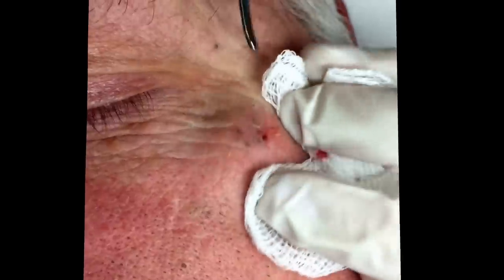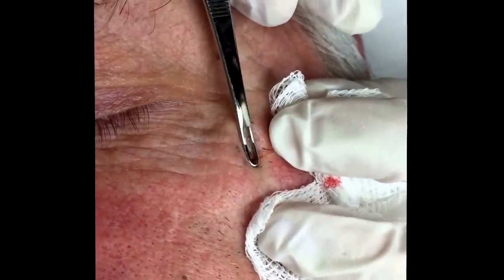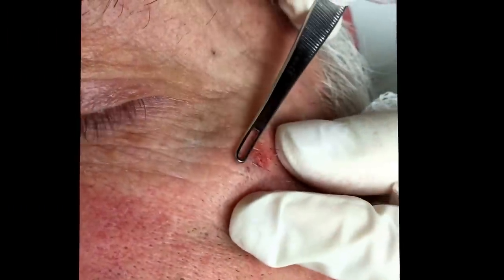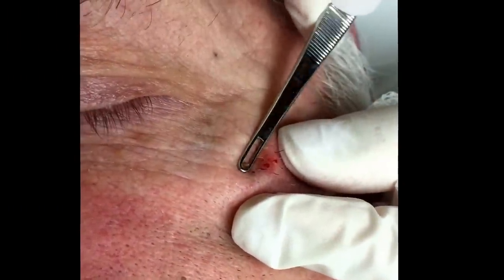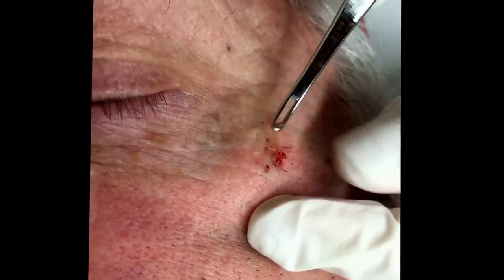See if I can get them out. Sometimes if they've been there for a while, they really are stuck in there. Did you see that one come out though? There'll be a little pressure — just pushing against your bone here, your cheekbone, so that I have some traction.